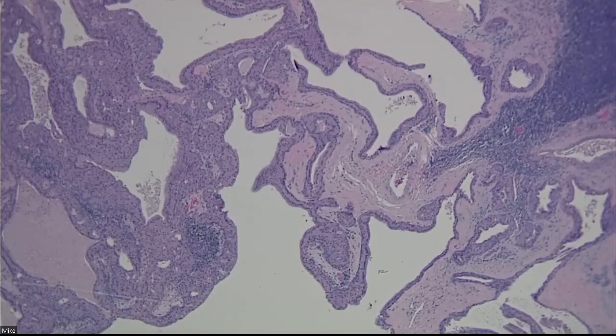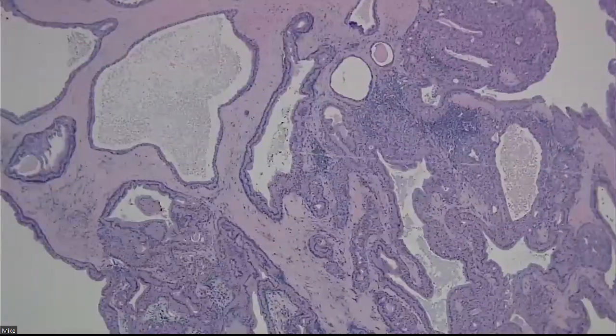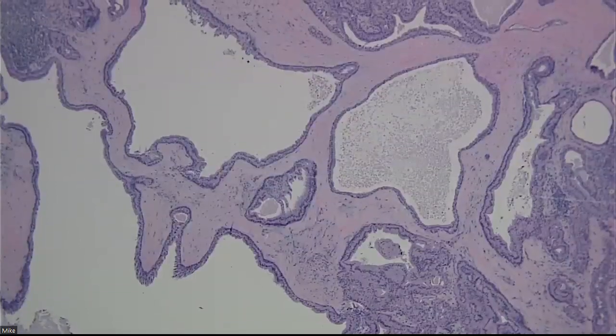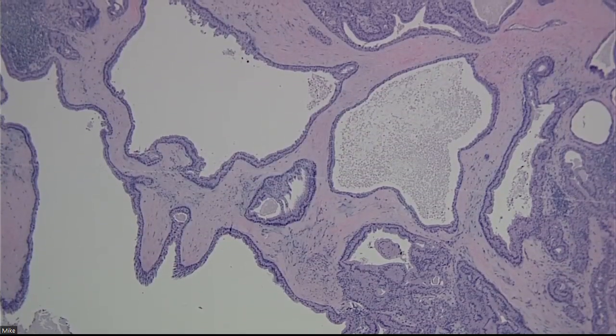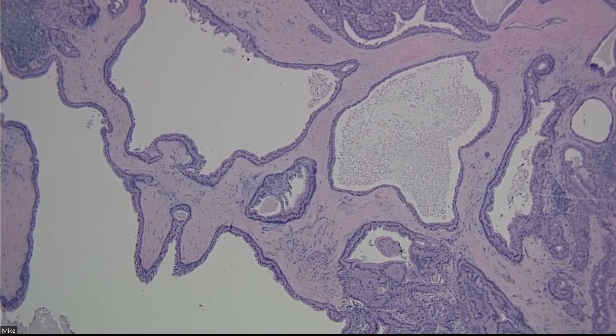But that's more of an important question on permanent, right? Because you want to make a diagnosis on permanent. On frozen, you really want to know, is it low grade or high grade, right? So even if it's a mucoepidermoid carcinoma, and you don't see mitosis or necrosis or significant pleomorphism, you still say low grade cystic salivary neoplasm with oncocytic features, pending permanent workup, no high grade features seen. For frozen, that's adequate. For permanent, then you can pursue things like MAML2 fusions for mucoepidermoid carcinoma or immunohistochemical stains, whatever. But for frozen, that's what's most important.